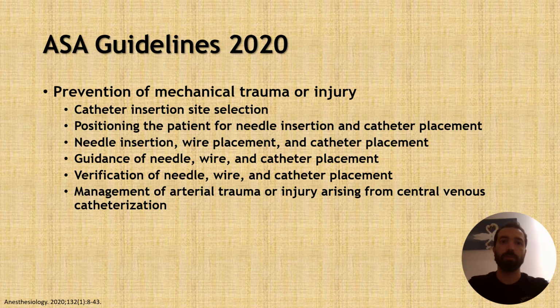There is also a separate section on preventing mechanical trauma and injury. It provides very detailed recommendations regarding the insertion site, patient positioning, needle entry, advancing the guide wire, catheter placement, and confirmation of its place.